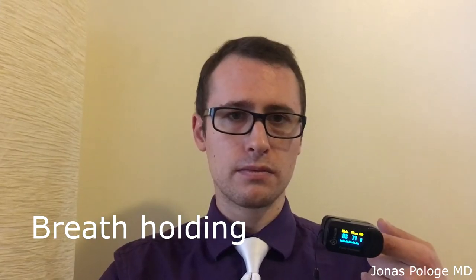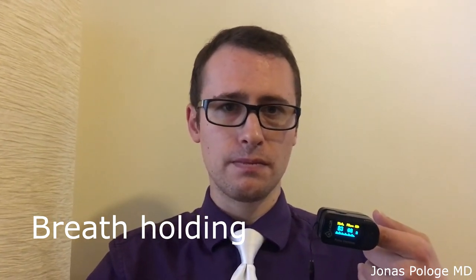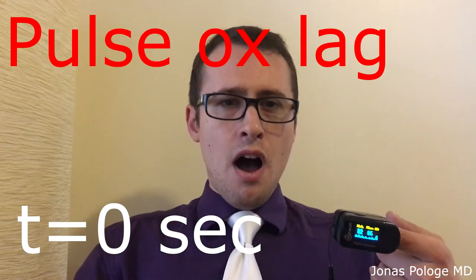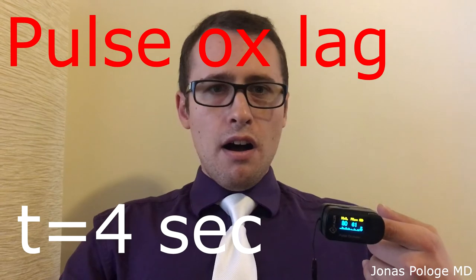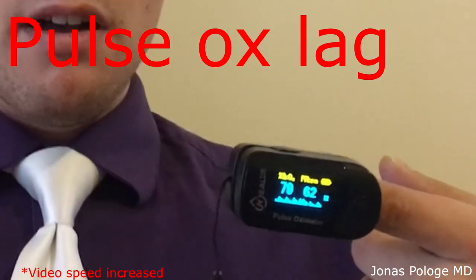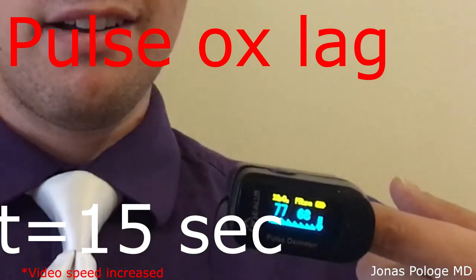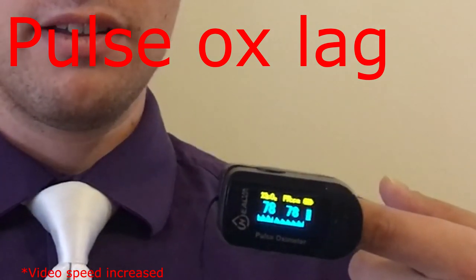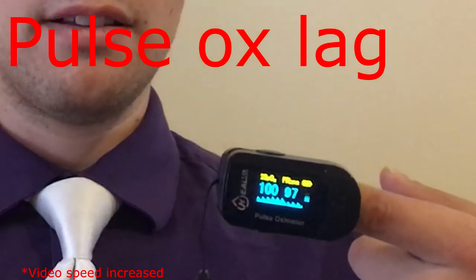It's important to appreciate pulse ox lag. There are many contributing factors to pulse ox lag, such as vasoconstriction, hypothermia, and poor perfusion of the oximeter site. Take a look at this video — look at the lag between the time when this perfectly healthy patient starts breathing and the saturation catching up. It takes about 25 seconds for his O2 saturation to go from 83 to 90%. We often abandon something that's actually working because of pulse ox lag. Recognize this lag.